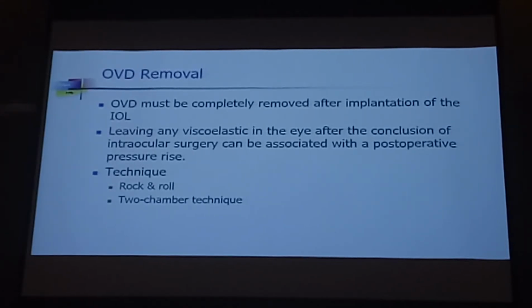OVD removal, at the end of the surgery, you must remove all your OVD, because any OVD that stays back will cause IOP problems, and if it's behind the IOL, it may cause capsular block syndrome, in which the IOL is pushed a little bit more anterior, the patient will have myopia. And some of the cohesive viscoelastic may get trapped in capsular block syndrome for a long time, and it may take even up to 3 months to clear. Alright, and they can cause some pressure problems.